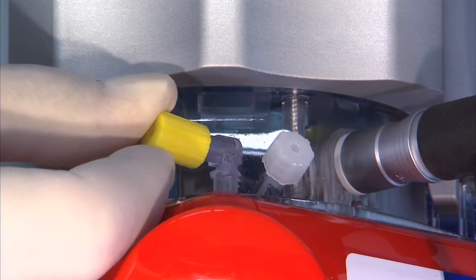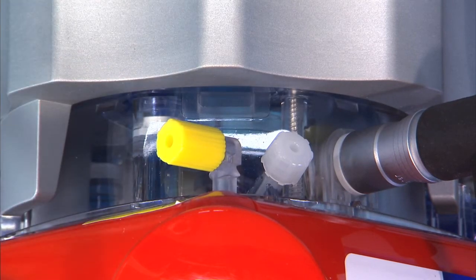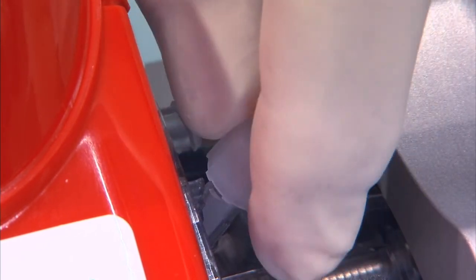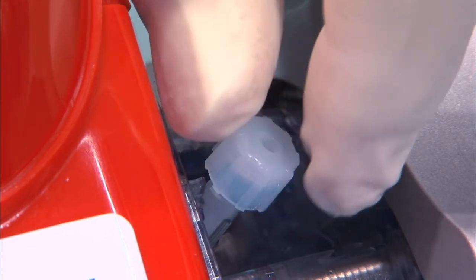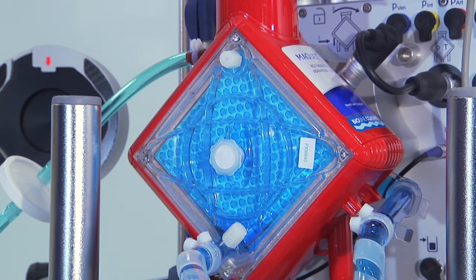Close the de-airing membrane with the yellow protective cap. De-air the lure lock connectors on the inlet and outlet side of the oxygenator. If further bubbles were detected during the preceding steps, reset the bubble alarm and repeat the last steps. Make sure that the entire set has been completely de-aired.